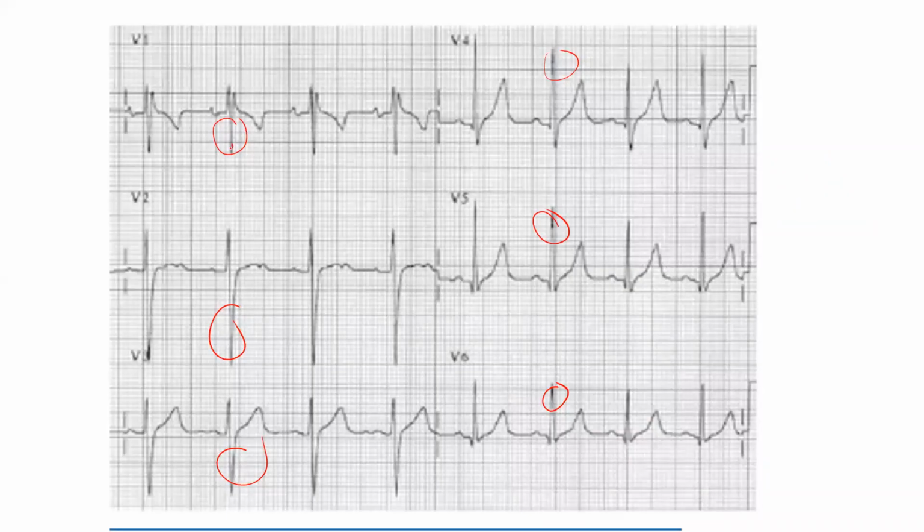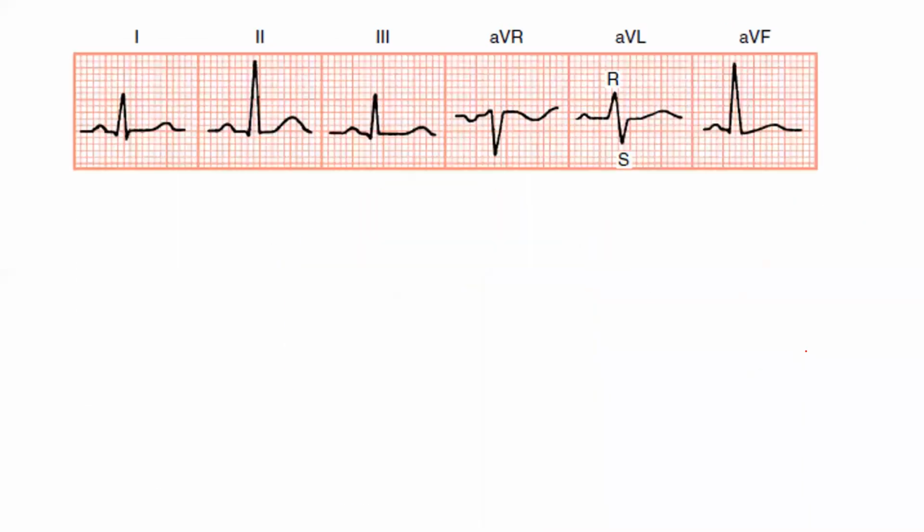Here see, negative to positive. It is almost having a normal progression. So this is the normal ECG which we have here. So there is no MI in the lateral wall. You can just tell it, it could be there, could be MI and all. So this is the importance of your lateral chest leads. Okay.